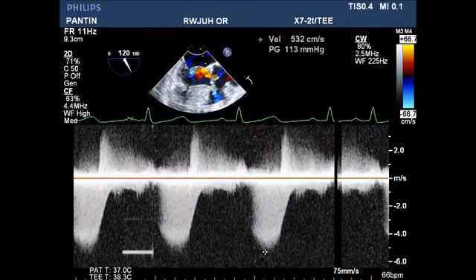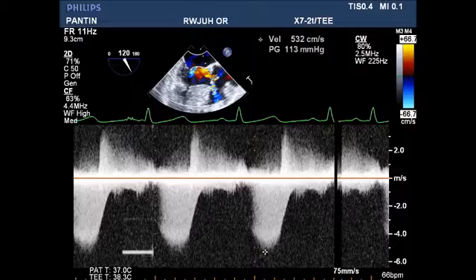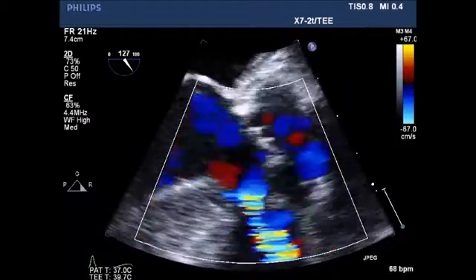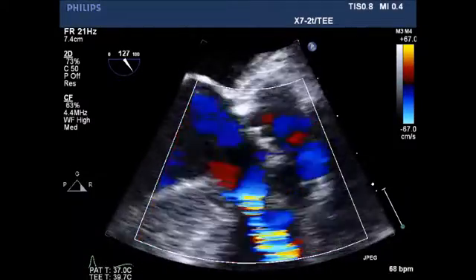Continuous wave Doppler done through the defect demonstrated a peak gradient of 113 millimeters of mercury, indicating a very restrictive defect.